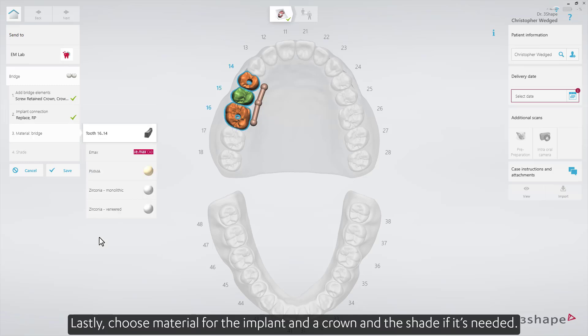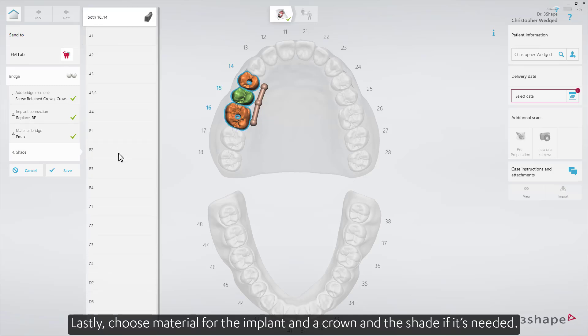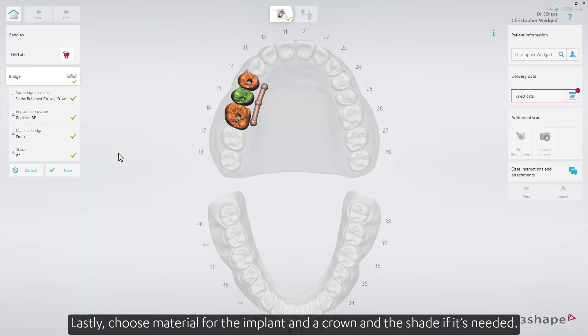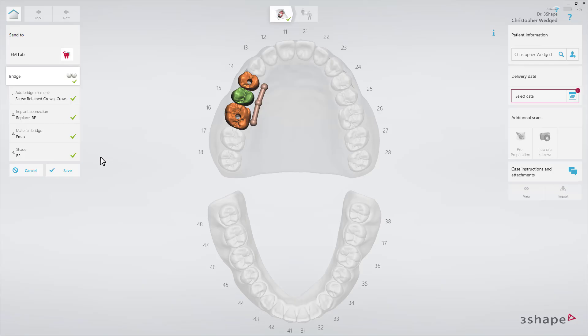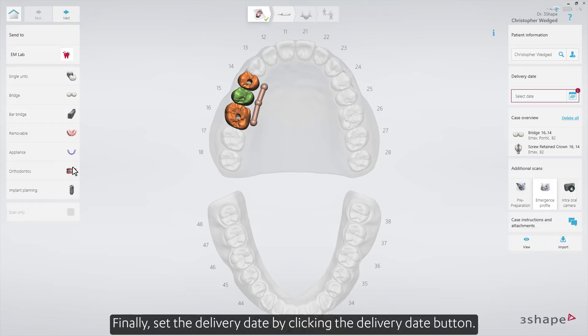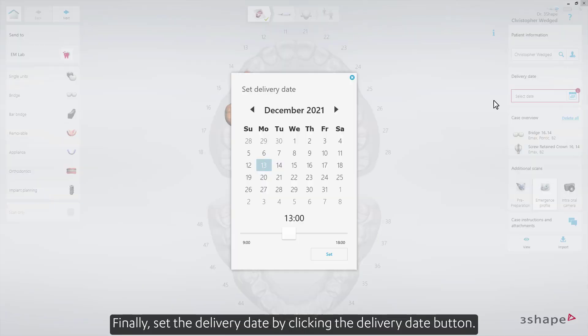Lastly, choose the material for the implant and a crown, and the shade if it's needed. Finally, set the delivery date by clicking the Delivery Date button.